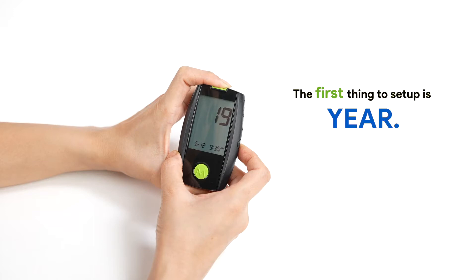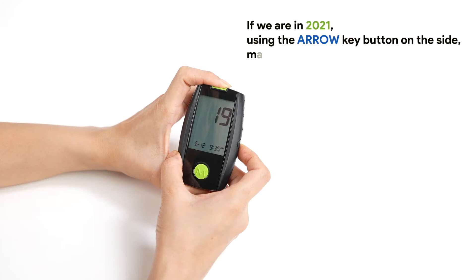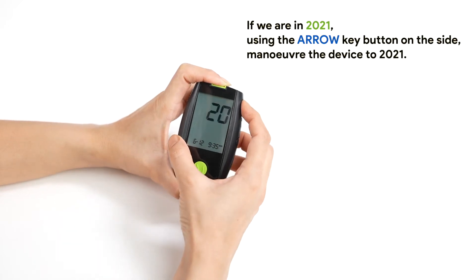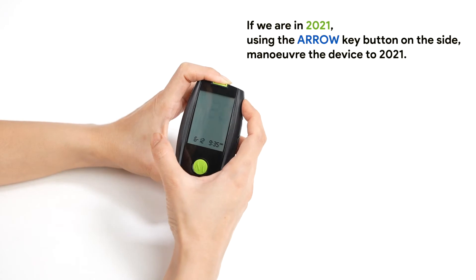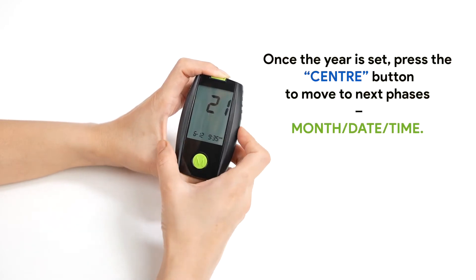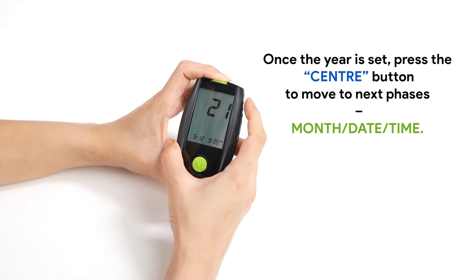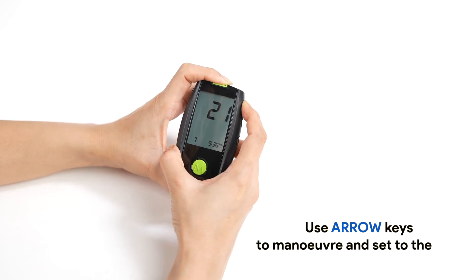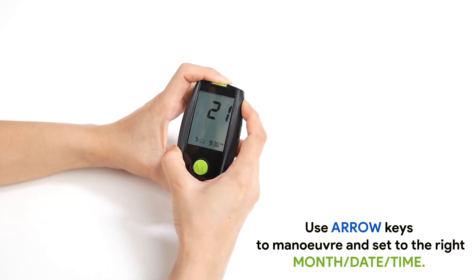The first thing to set up is the year. For instance, if we are in 2021, using the arrow key button on the side, maneuver the device to 2021. Once the year is set, press the center button to move to the next phases: month, date, and time. Use arrow keys to maneuver and set the correct month, date, and time.